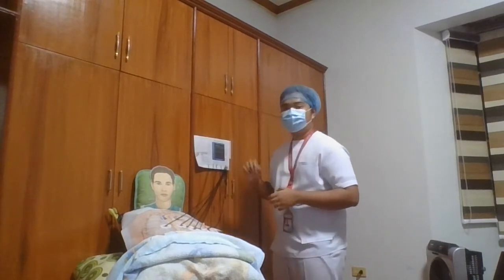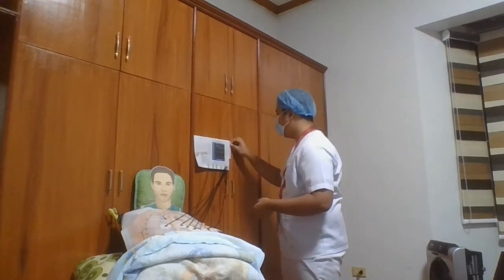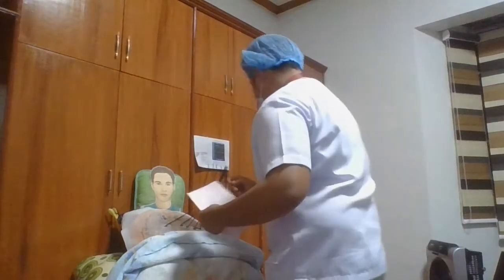We're going to turn on and activate the machine. And then now we're going to review the printout of the EKG to verify that the tracings are clear and confirm the absence of artifact. If artifact is observed, we're going to repeat the recording after checking.